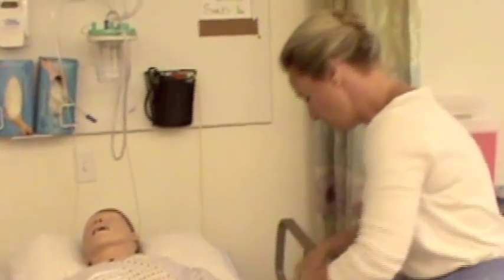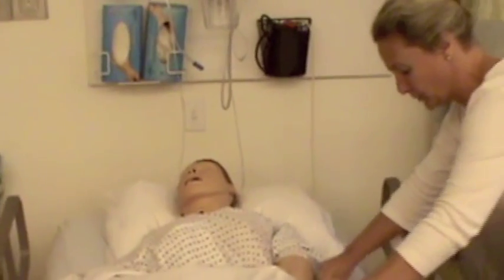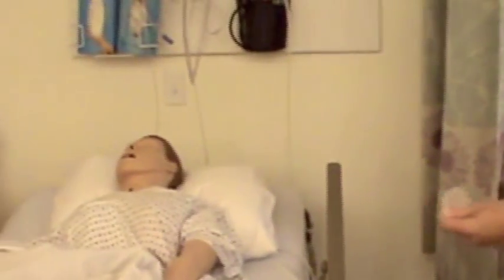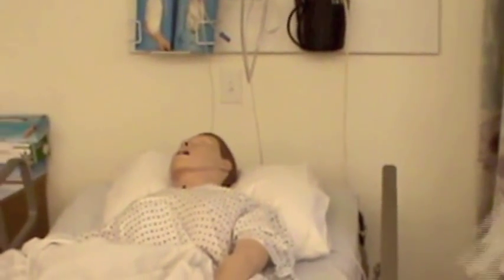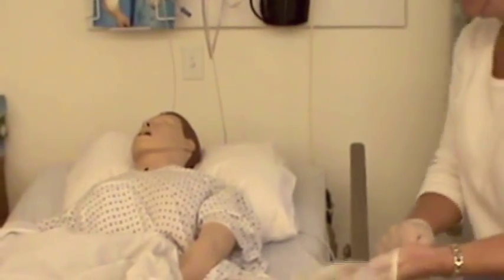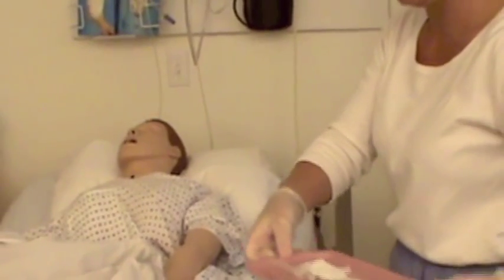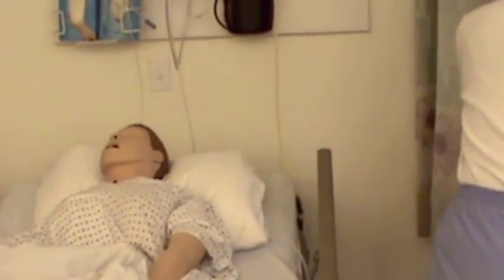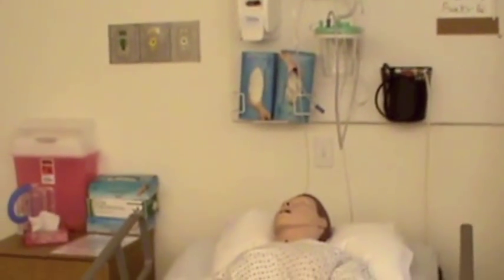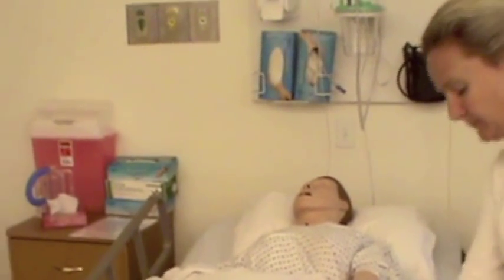Okay, and then I'm just going to expose your gluteal region. This shouldn't be set in the bed. I should be actually having a bedside table to set this in. Okay. Okay, and then I'm going to just find the landmarks, Mr.